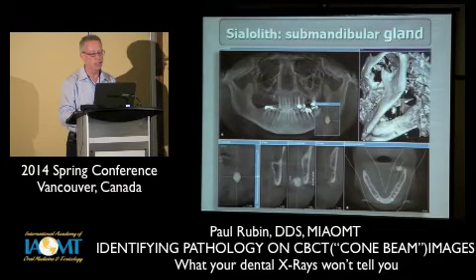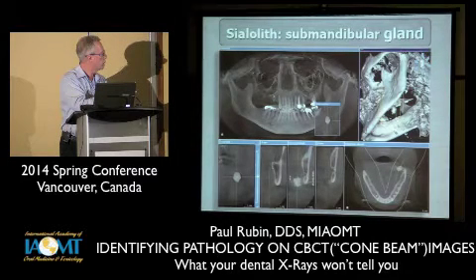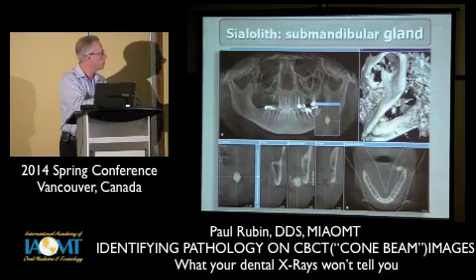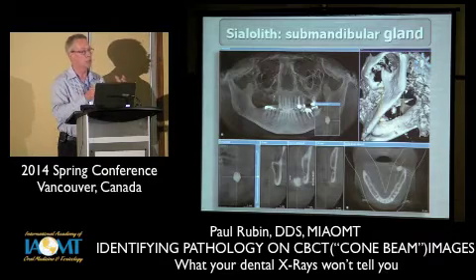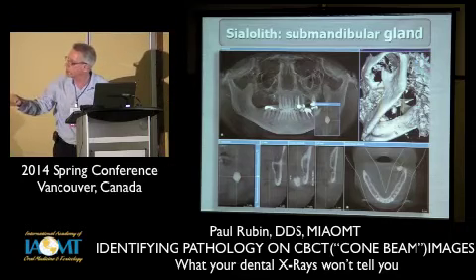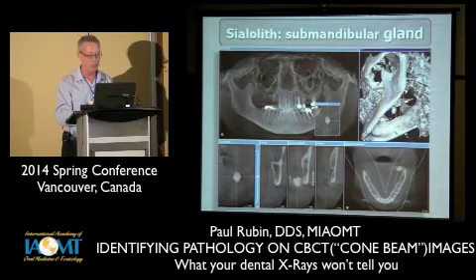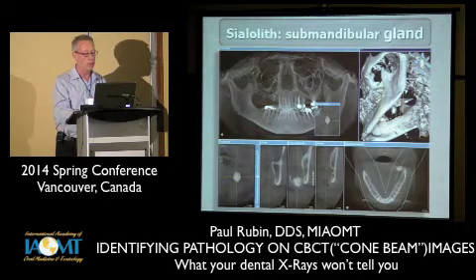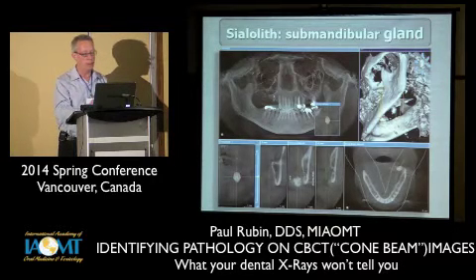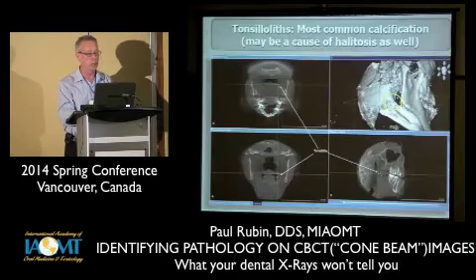Sialoliths, again, another calcification. By looking at it in 3 dimensions, can't see it as well here, but on this is another type of view you can get on the image, and you can rotate this skull in a bunch of different ways and see just where this sialolith is, which I think if I'm pointing correctly, it's here. I can't point that well from being so sideways here. But on the bottom, you can see the different views, axial, tangential, etc., to see where that was.